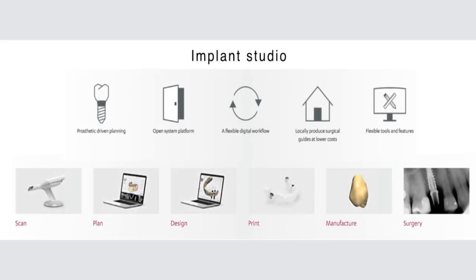3Shape has a software called Implant Studio. In my presentation, you're going to see Implant Studio being used by me. Some cases I have developed myself, some I have outsourced. And this is what we face now. In a busy practice, depending on the treatment you are proposing, sometimes it's really time consuming to design. For instance, if you have an overdenture, I'm going to show a case of overdenture. It takes some time. But single units, one can design if you wish.